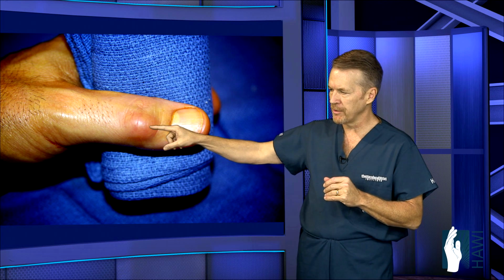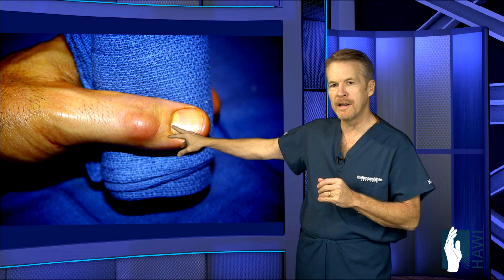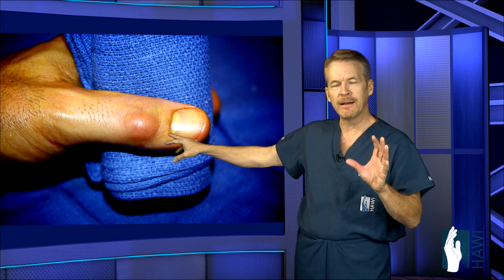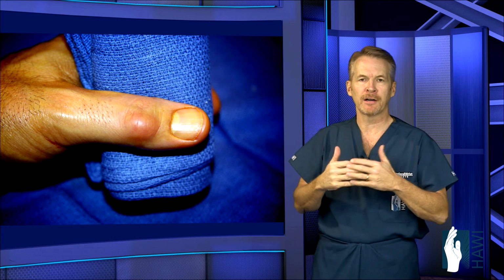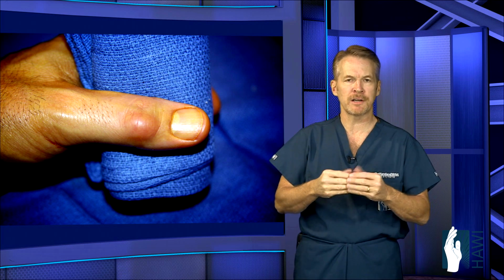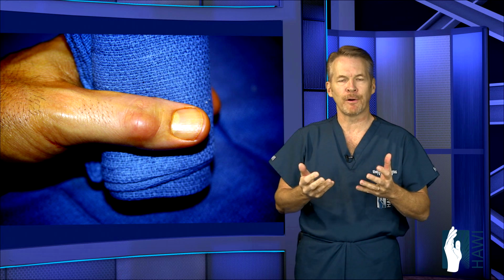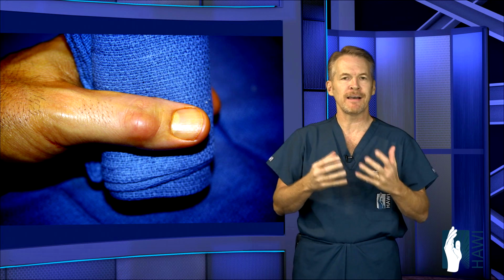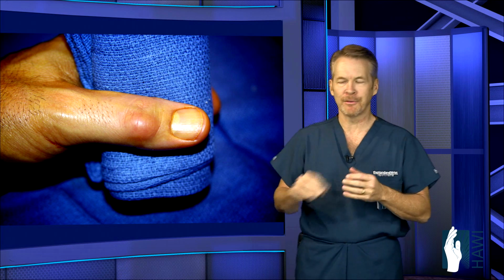In this patient, you can see a large bump right over the distal interphalangeal joint. There's no nail plate abnormality. So in a lot of patients, they will have seen a dermatologist or other doctors and will have gotten multiple cortisone injections or sucking the fluid out of the cyst. That can provide temporary relief, but usually that's not curative unless you go in there, remove the cyst, and take out the spurs. So let's take a look.